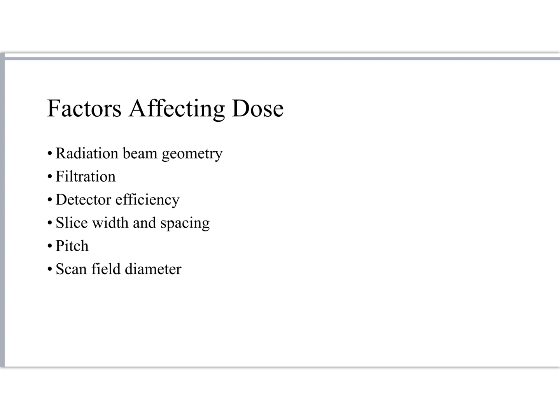Pitch. As pitch decreases, radiation dose will increase. So it's a reverse or inverse relationship. Pitch is the distance that the table's moving through the tube. So basically I'm saying that the table's moving slower. That's an approximation. The table's moving less, and so per scan, the patient dose is going up. We're essentially increasing the time that they're inside the tube, or inside the gantry, I should say.